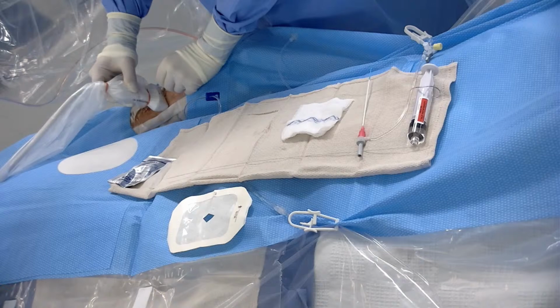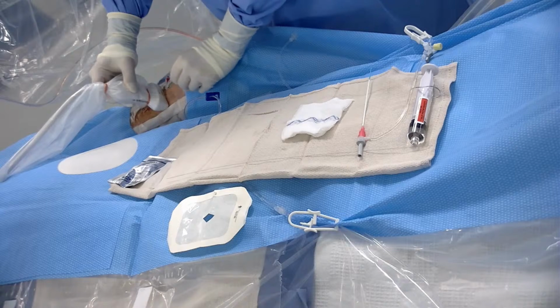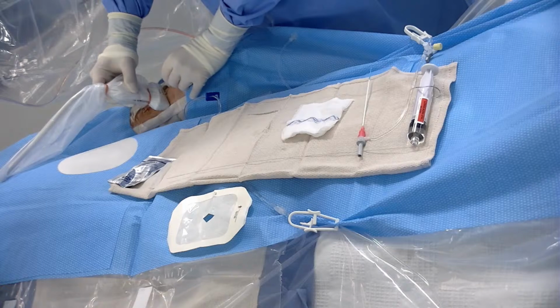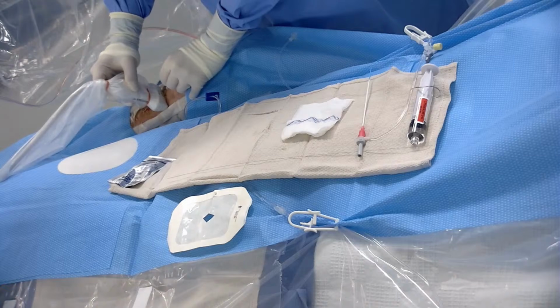In terms of radial access, it's a shallow angle into it. We did check a Barbeau beforehand; it was a Barbeau B. We did prep the right groin just in case. Sometimes these patients are taller on the inside than they are on the outside, but I think we'll be okay, and we'll go from there.